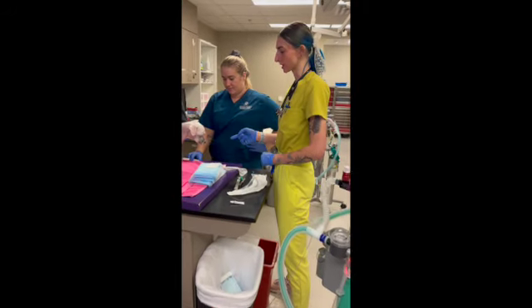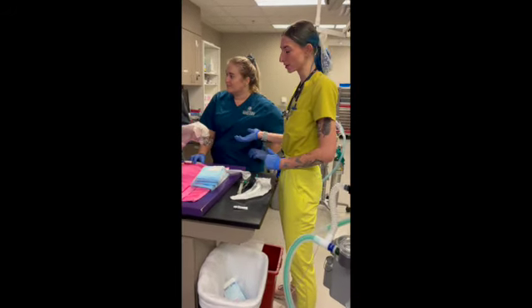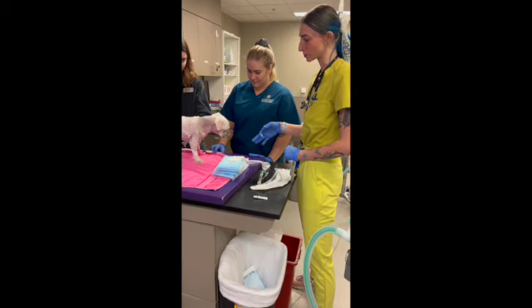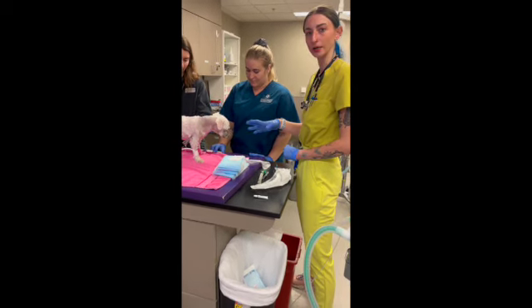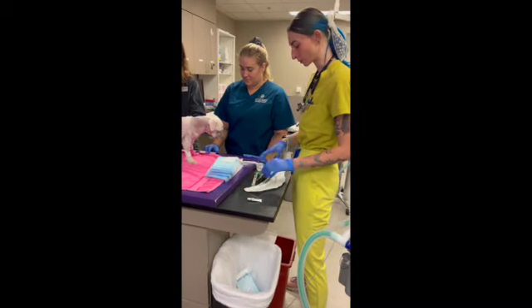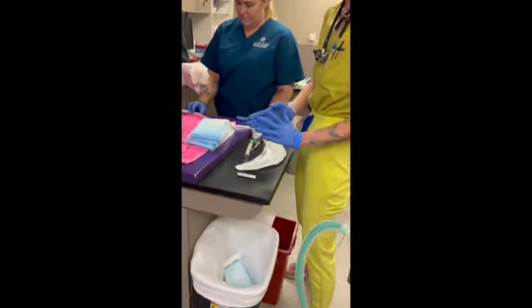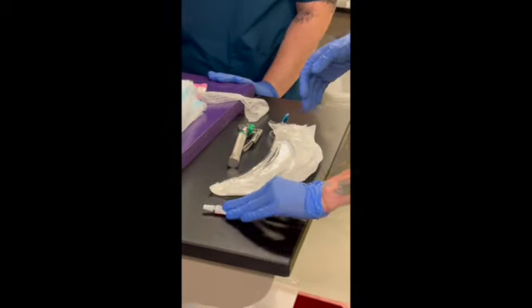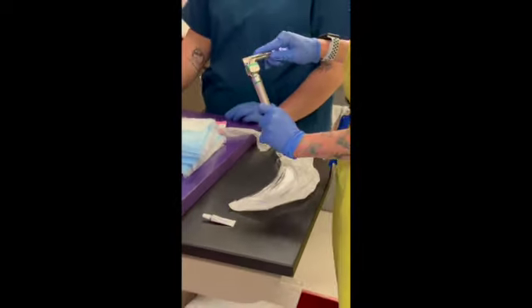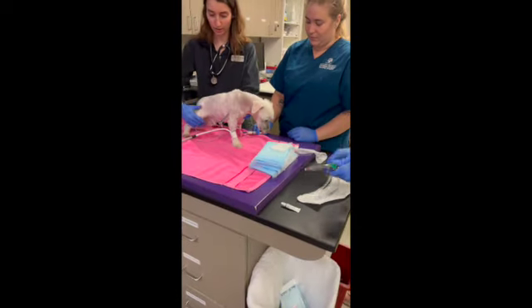So we are having our coworker go ahead and start slowly titrating our propofol so that our patient can start going down to their anesthetic depth. We have our tube already prepped and ready. The end has been lubricated. We have our eye lube ready. We have our gauze tie, our tongue gauze, and our laryngoscope ready.